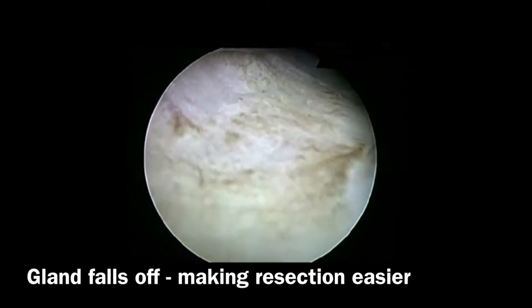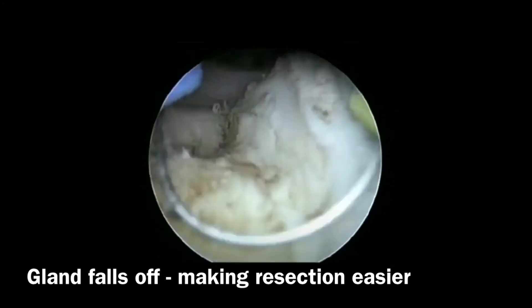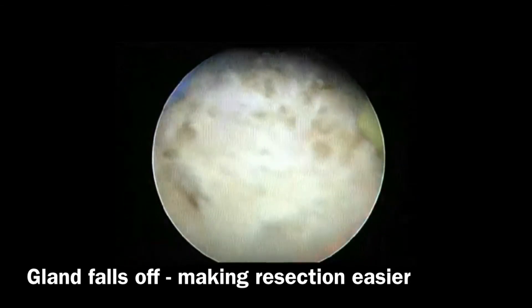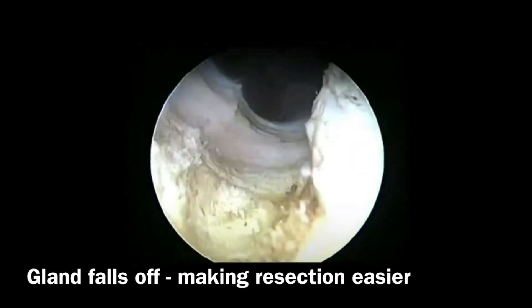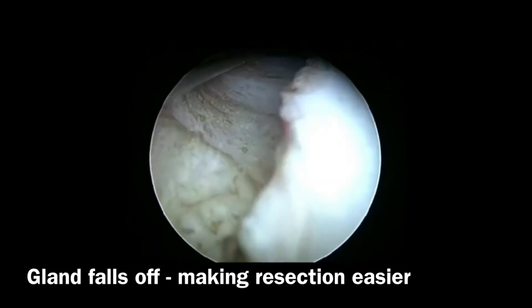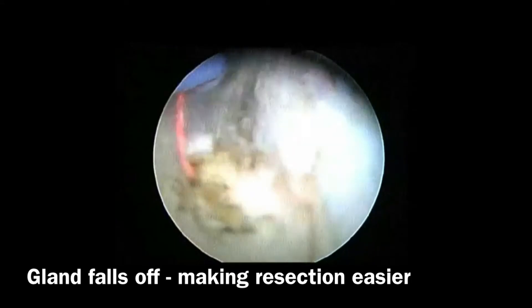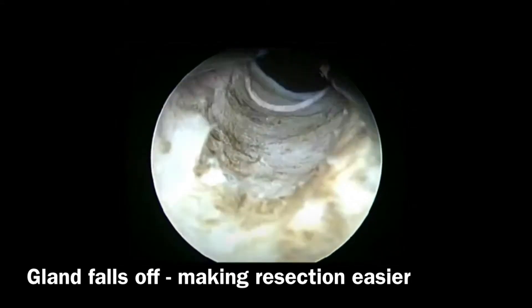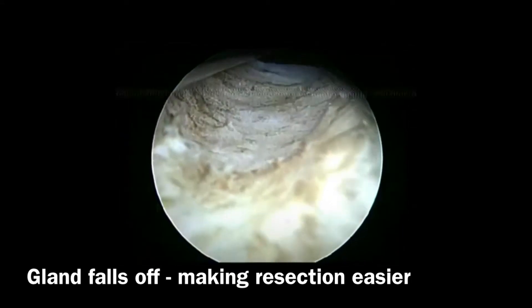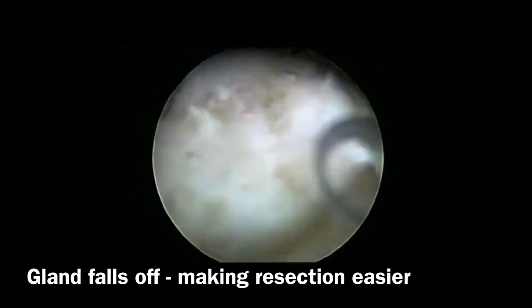As the resection is being done, we make sure that we don't extend beyond the Veru. In case of resection beyond the Veru, there are chances of the external sphincter getting injured and the patient can result in incontinence. So the Veru forms an important landmark during resection.